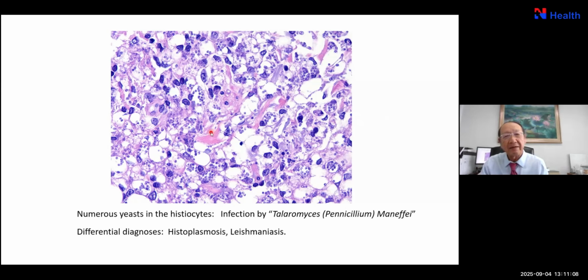So right now, we know that if there are too many of them, they are Penicillium marneffei. If only a few with granulomatous reaction, then they are likely histoplasmosis. But anyway, all the fungi diagnosis must be confirmed by culture. Okay.